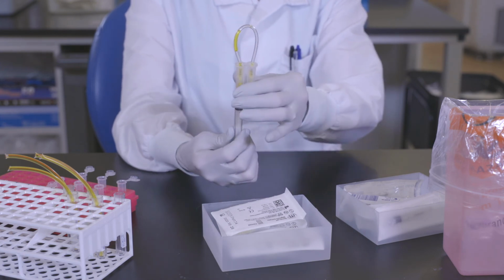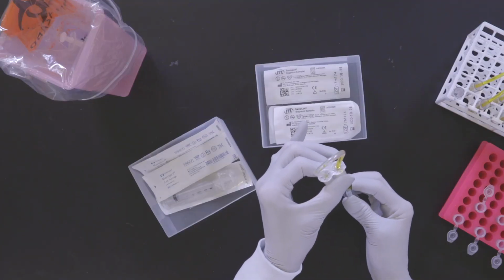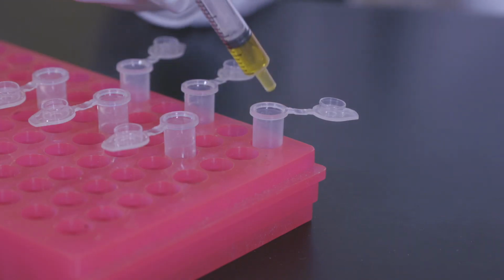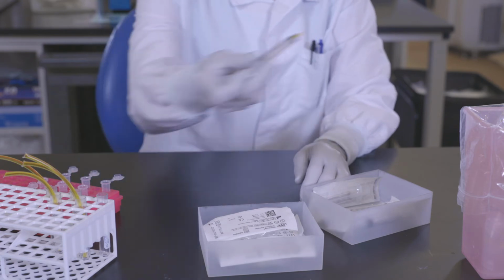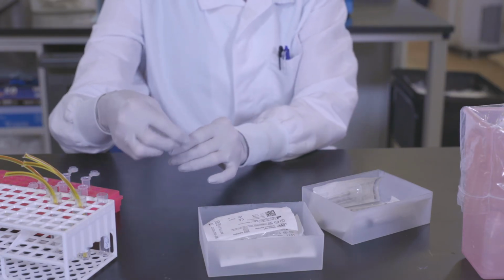Now, detach the syringe from the segment sampler and discard segment sampler per your facility procedure. Do not remove the segment from segment sampler. Transfer the sample from the syringe into a designated test tube or other device as per test instructions. Discard syringe per your facility procedure.